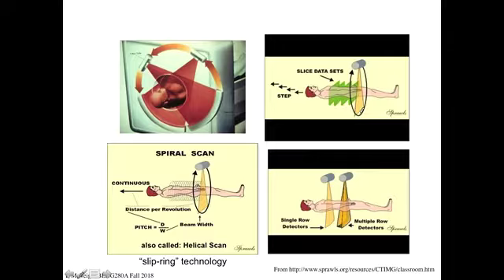And we'll see a movie. That presents an engineering problem in that you have to design stuff that can put up with the g-forces associated with something spinning at 5 hertz. So 800 kilograms of stuff spinning at 5 hertz, which is why Siemens and GE and Toshiba, these heavy iron companies, make this stuff, right? It's like GE makes jet engines, which spin faster. They also make washing machines. They spin pretty fast.